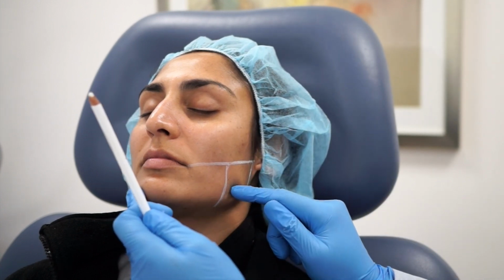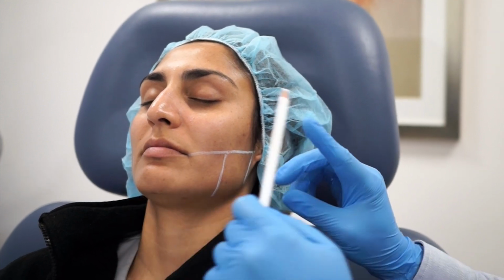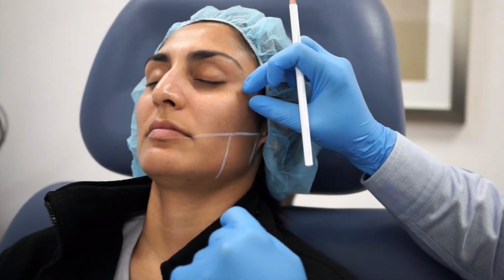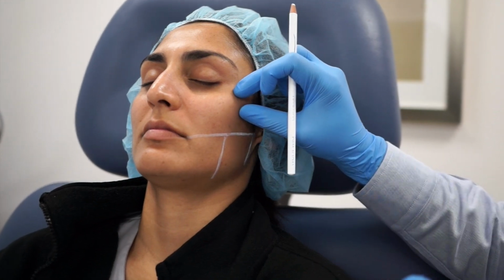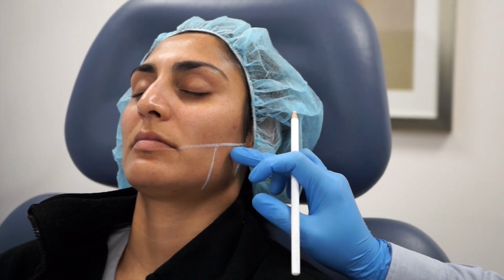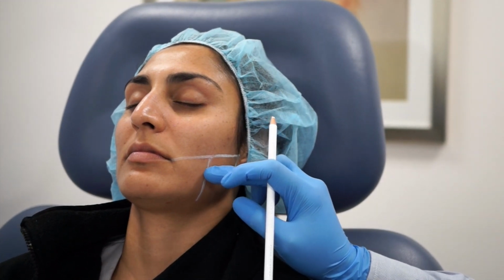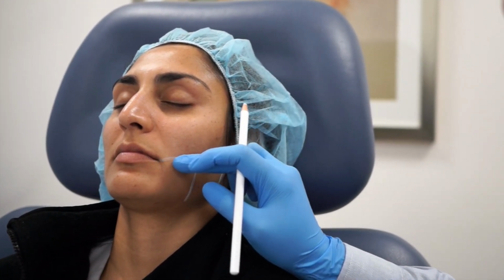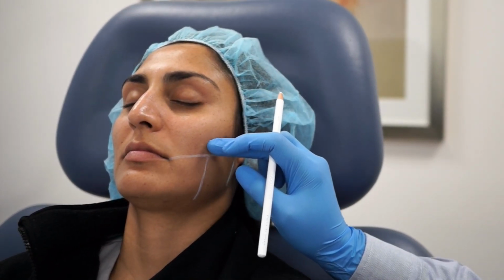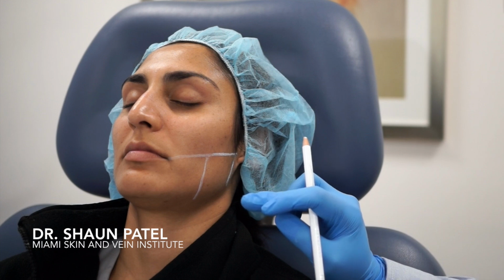Alright, and we've got the heart of our injection right here. Bite down for me. You can feel the injection right there. The reason we have this border right here is we don't want to get into some of the mid-face musculature, including the zygomaticus major, which is a lip elevator. And the reason I mark out the anterior border, and we stay within a centimeter outside of the anterior border, is because there's a muscle here called the risorius, which is responsible for smiling, a muscle that contributes to smiling, and we want to avoid that muscle as well.